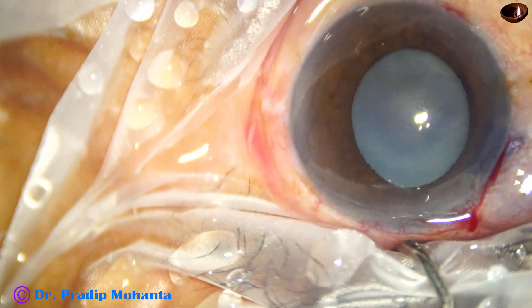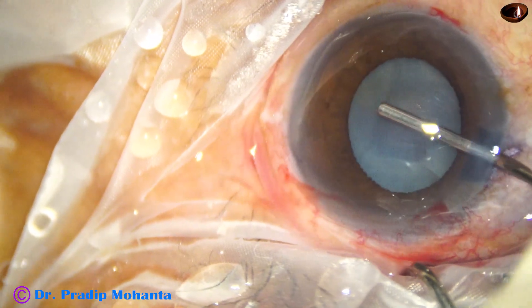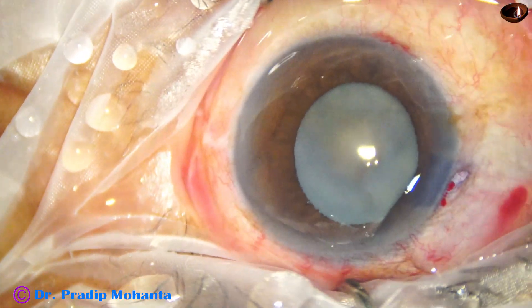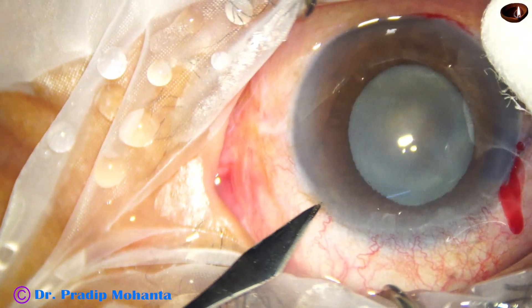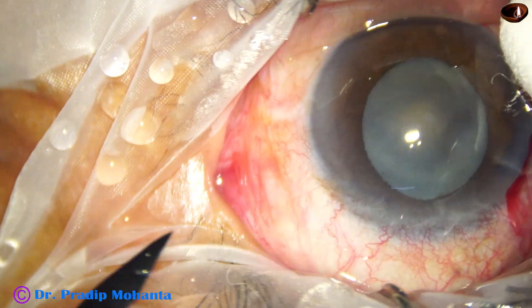Now the anterior chamber is filled up with 2% hydroxypropylmethylcellulose. And then the sideport on the left side is made about 3 o'clock hours away from the main incision.